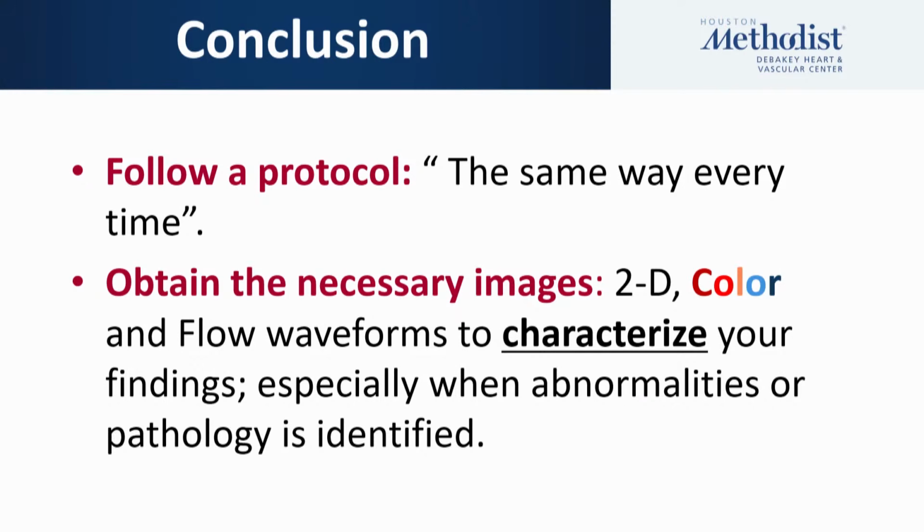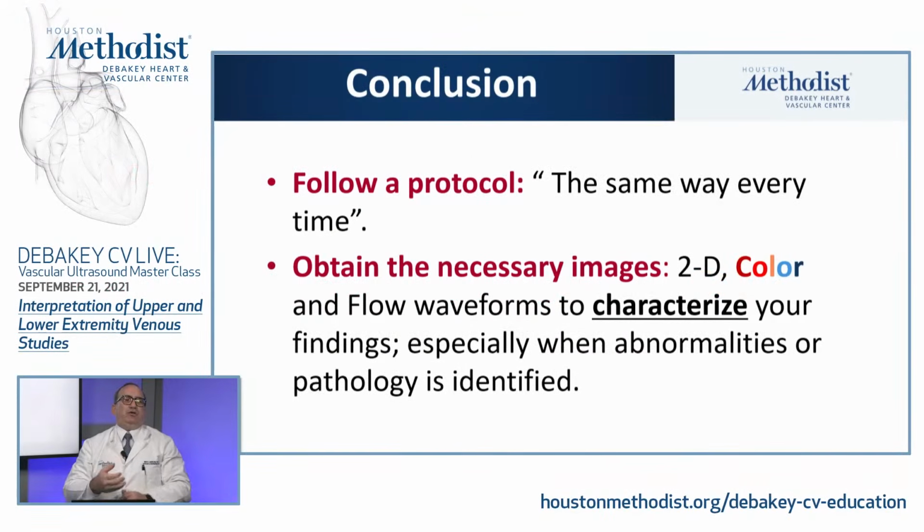So in general, you need to follow a protocol. You do it the same way every time. Why? Because it's going to become almost a reflex action when you do your ultrasound. Number two, it is going to provide you consistent images and consistent reads, and the physicians who are reading your tests to make a clinical decision will rely on your assessments more readily.